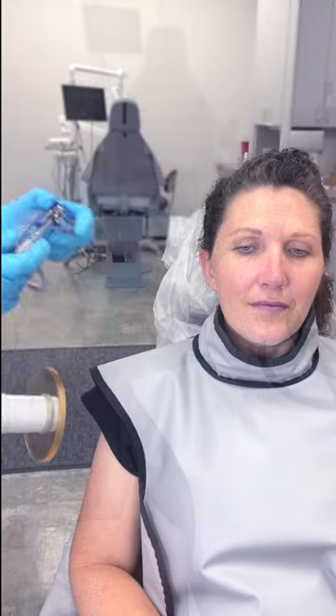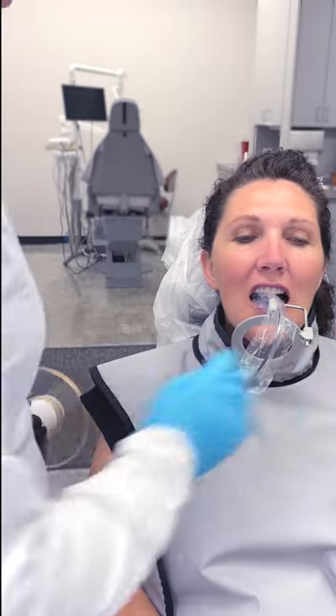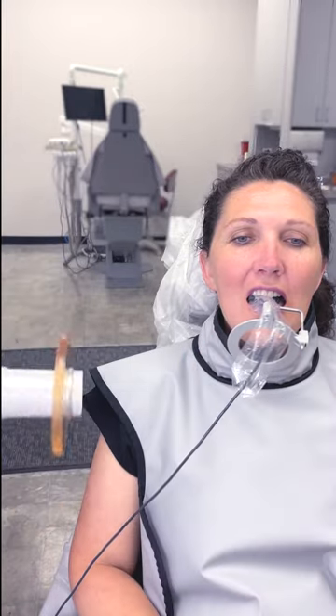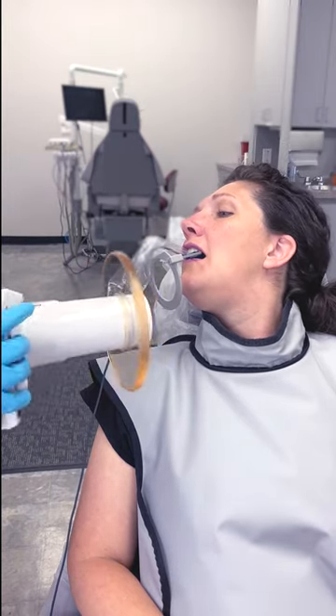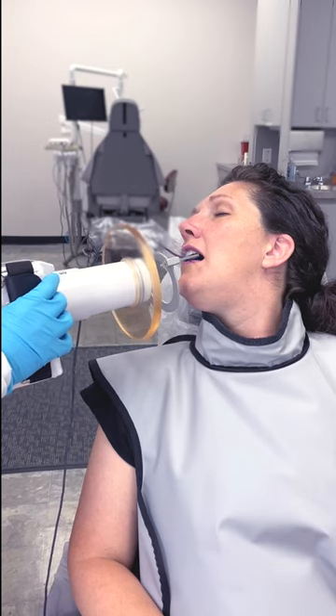When taking a lower anterior PA, instead of bringing the unit like this and irradiating you, you're going to have your patient move towards you and lift their chin really high, and then you are able to maintain a safe zone.